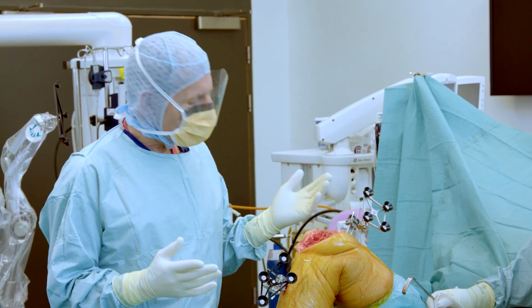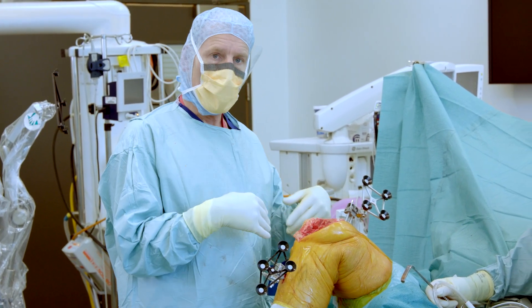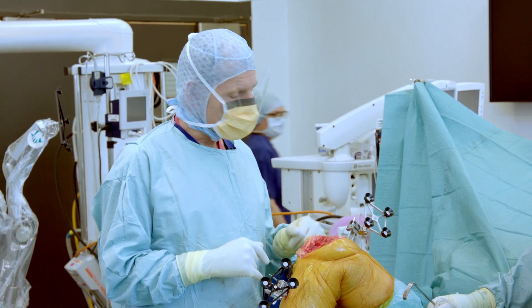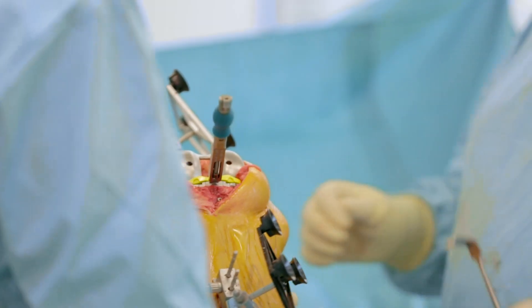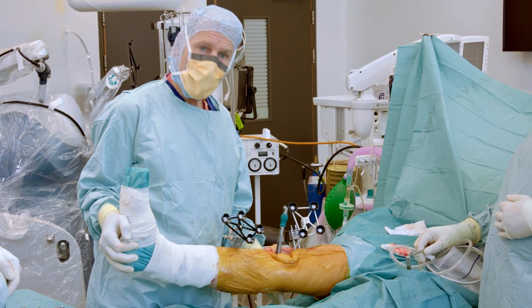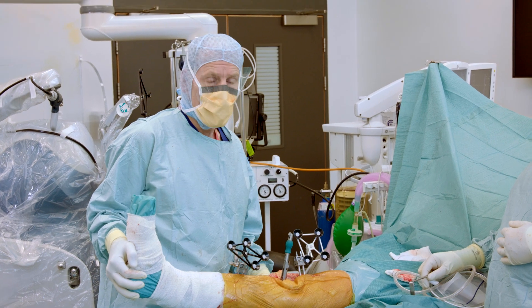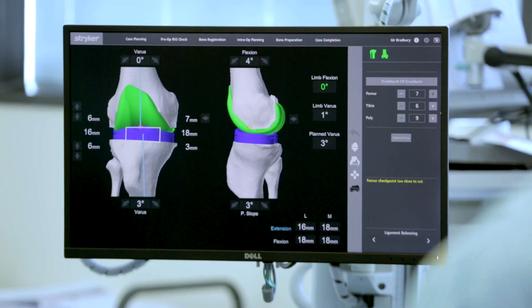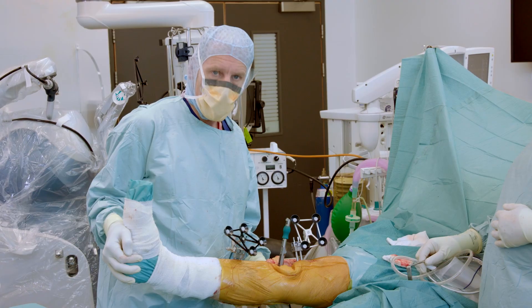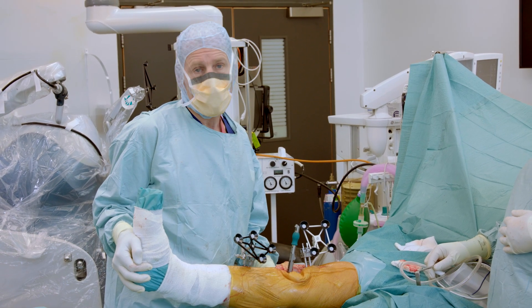All we have to do now is fit the knee replacement. The key question will be whether I have to do any soft tissue releases, or whether it will fit perfectly and have corrected the alignment. My view is that this robot allows me to really personalise what I do for each patient. We've now put the trial in, and what the machine is telling us is that from a knee that he couldn't straighten, it is now straight; from a knee that was once bowed, it is now straight; and the balance is exactly what we want.